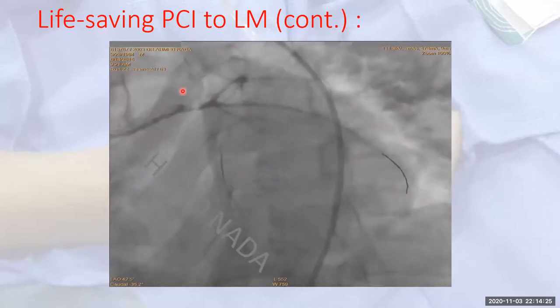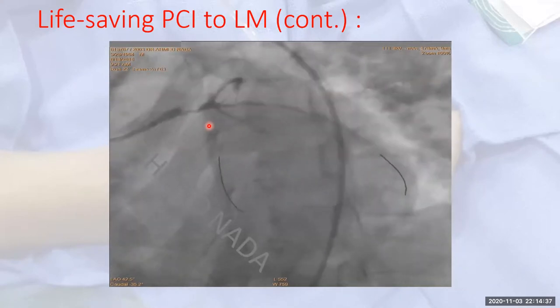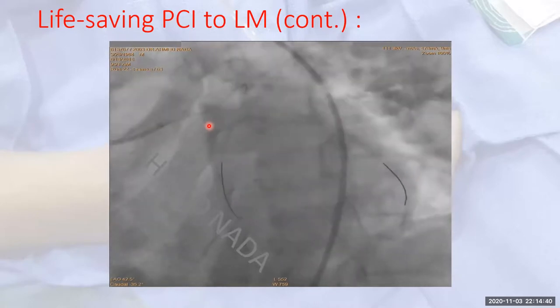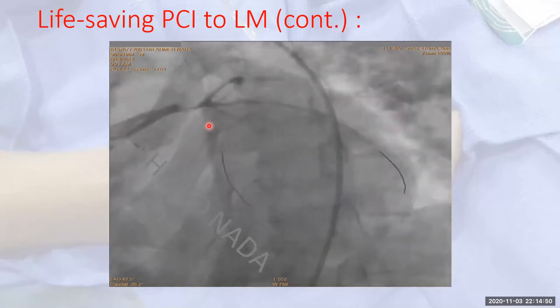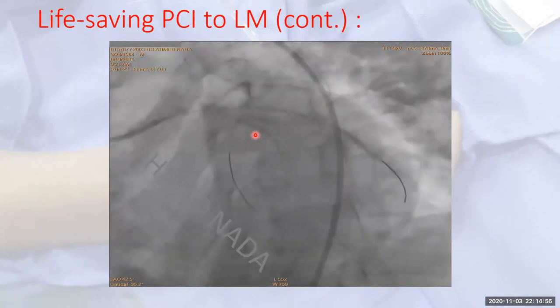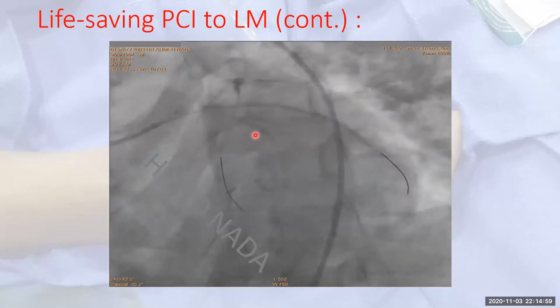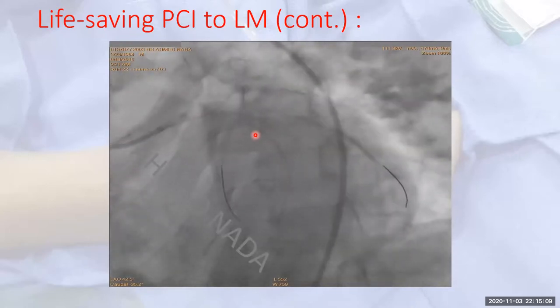And again, I'll point out here that what we see here, actually, is a tight lesion in the left main. It's not a thrombus. And we realized this by using a larger balloon, which was the 3 millimeter balloon, and we found actually there is a waist on that balloon. So I'm not encouraged to just push whatever through this lesion, despite I tried to dilate it many times. So at that time, I came to review the angio, and I realized that all the vessels are diffusely diseased. And this is the typical nature, coming back to the history, in diabetic patients. And I can't go through every single vessel to dilate it up to the apex. This is not logical in such a situation.